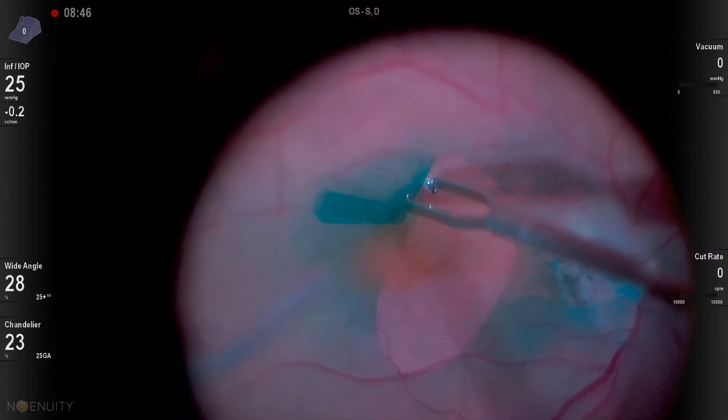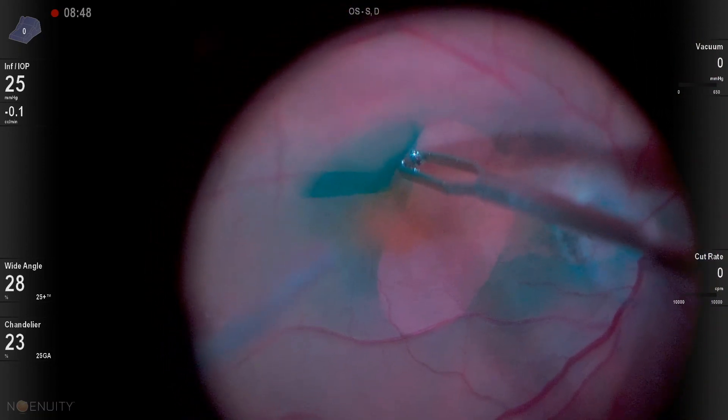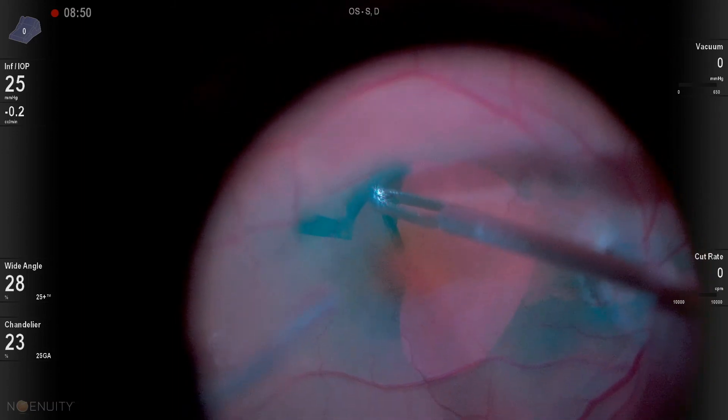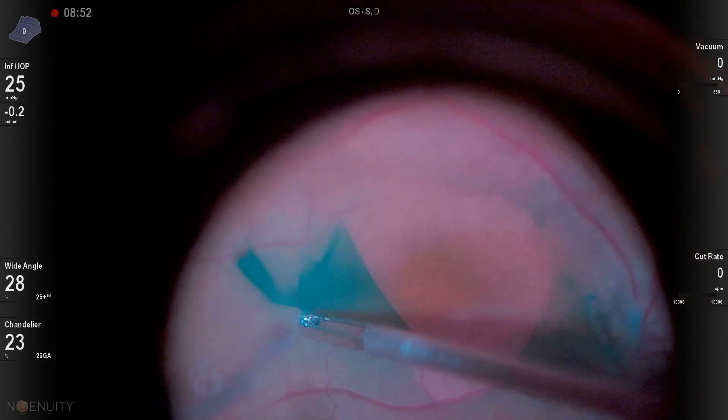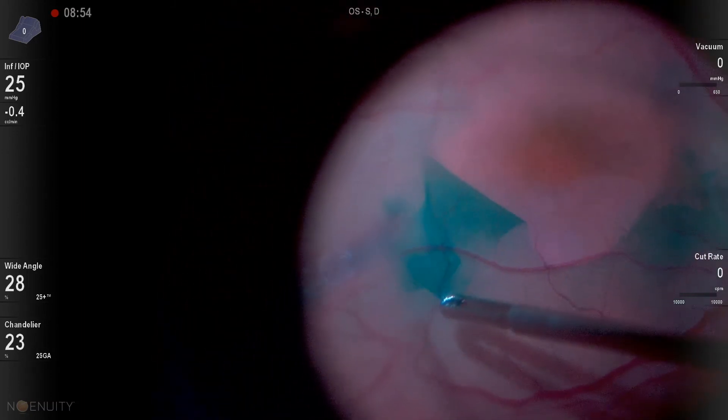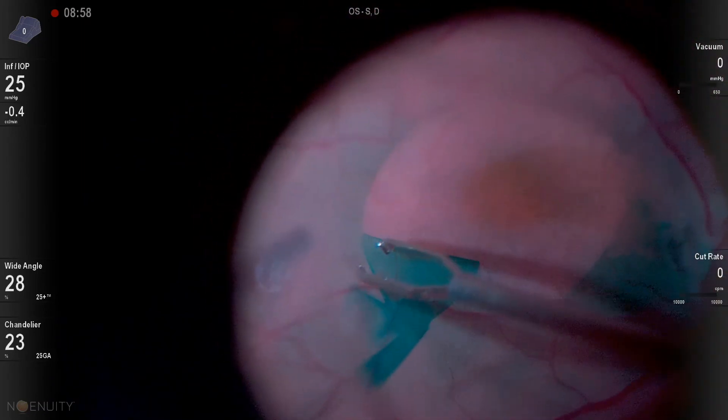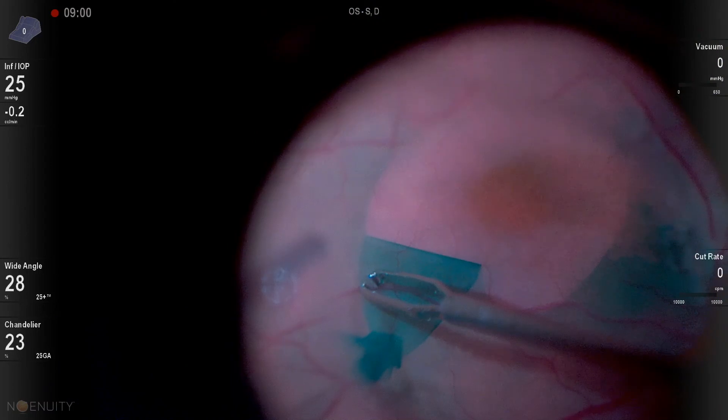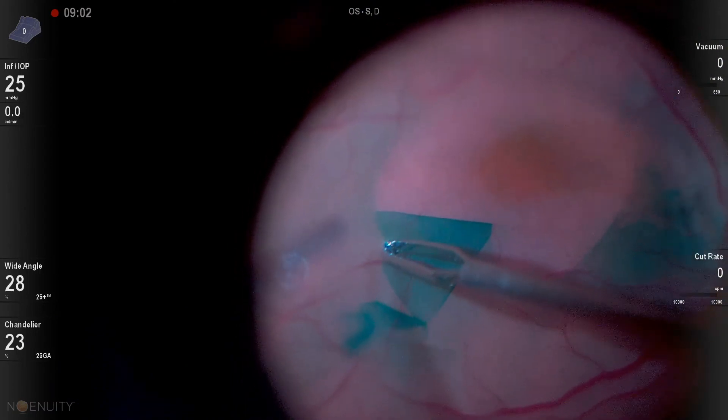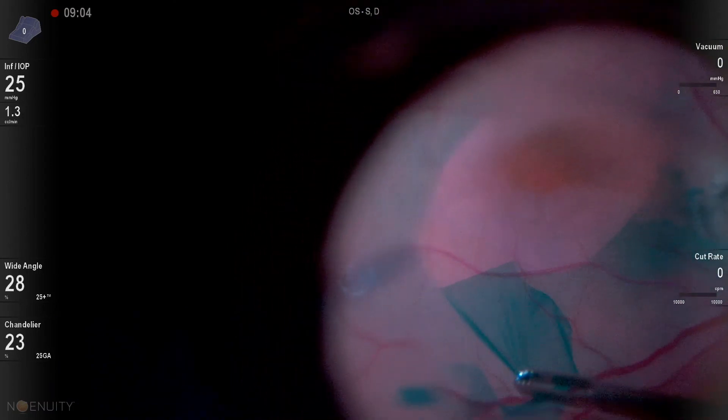But despite that, I was able to get the ILM up really nicely in one really nice kind of widespread confluent sheet. Now, in the past, I've tried to tuck this ILM back into the disc pit hole, and I just find that's not successful. So I just go ahead and peel the ILM and remove the ILM from the eye.